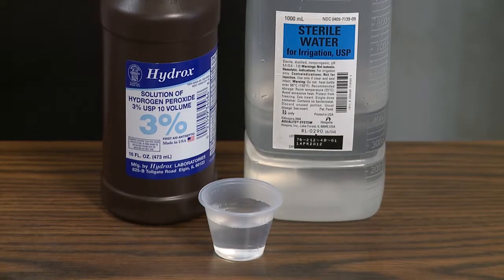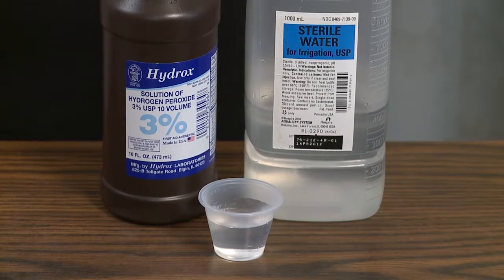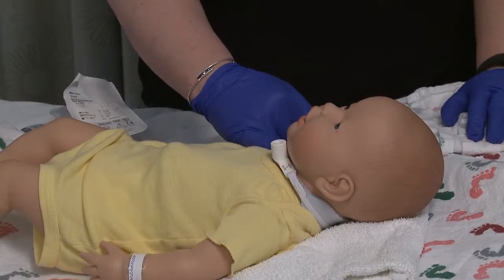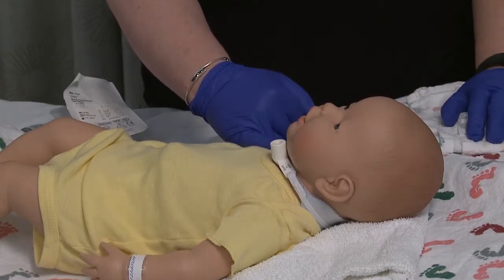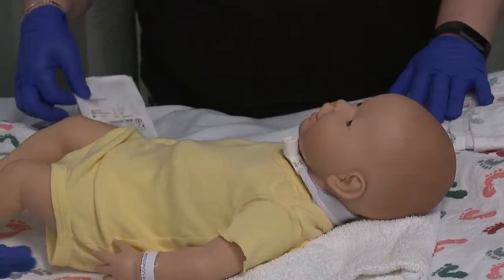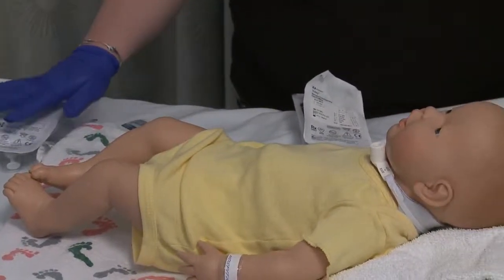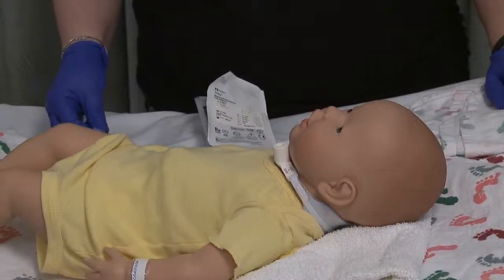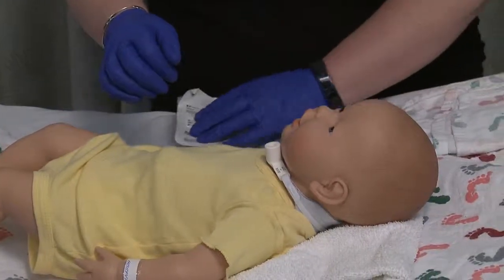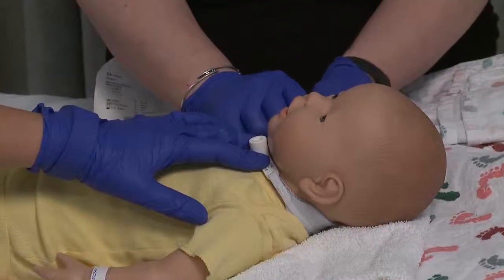When doing trach care, your provider will instruct you as to using hydrogen peroxide and sterile water or perhaps just sterile water — follow their instructions. You will always have a second set of hands at bedside to help you with this process. It's important to have the tracheostomy that you're changing to and one size smaller at the bedside when you're doing this, along with some lubricating jelly, suction, and a new trach tie. The second set of hands will hold the tracheostomy in place as the person takes the trach tie off.